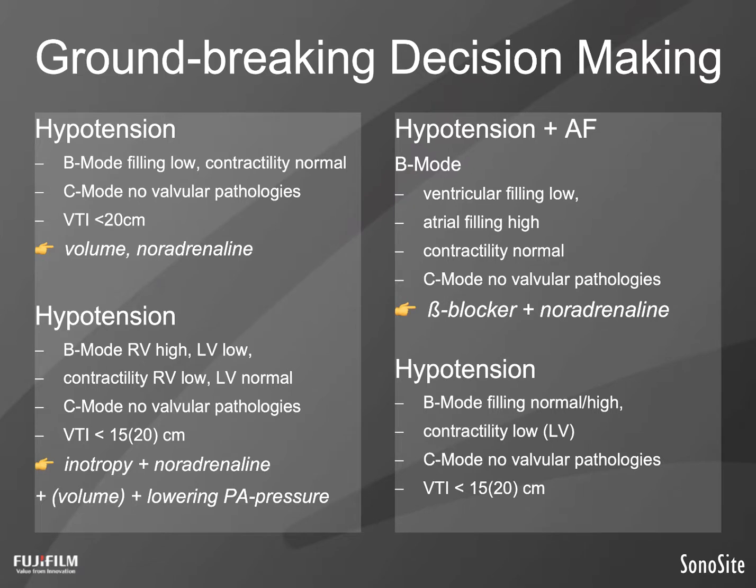However, one should always keep in mind that there are also sources of error in the measurements and eyeballing qualities. Nevertheless, after a short settling time, the TTE will soon become a powerful tool in decision making. In summary, TTE usage in perioperative care is an important tool to improve and optimize therapy, in particular decision making.